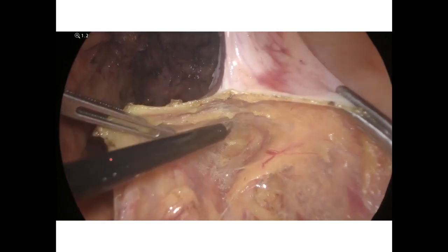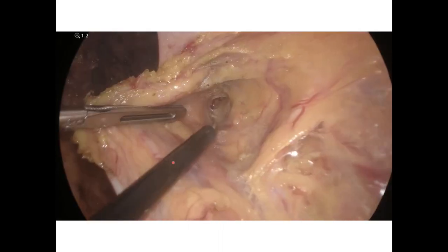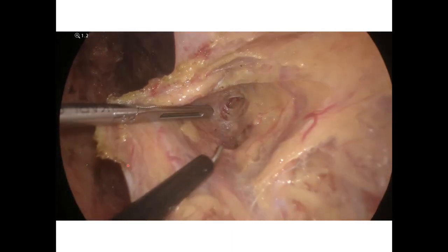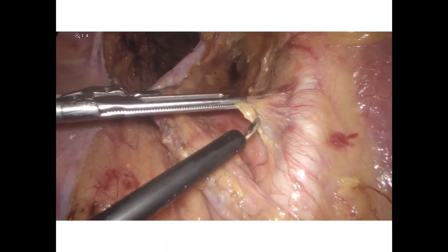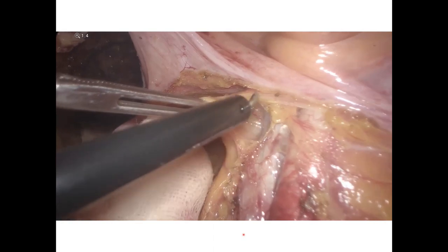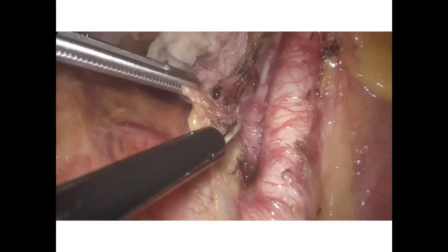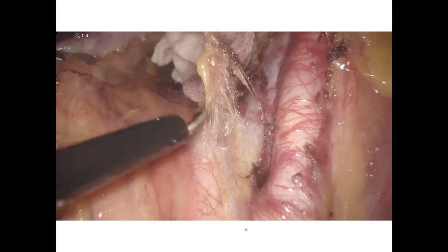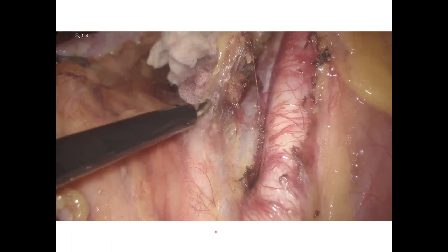The first step is to isolate the ureter. The dissection is performed along the pre-hypogastric nerve fascia. Here we can see the ureter. The next step is to expose the external iliac artery and vein. This is the external iliac vein. The cranial border of LPLD is usually the bifurcation of the external iliac artery and internal iliac artery.